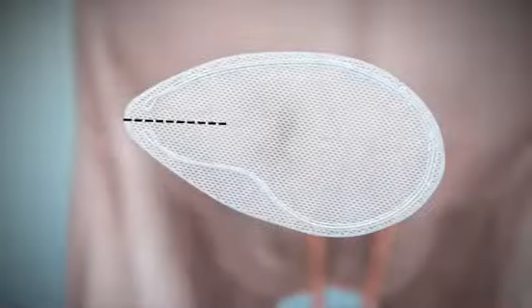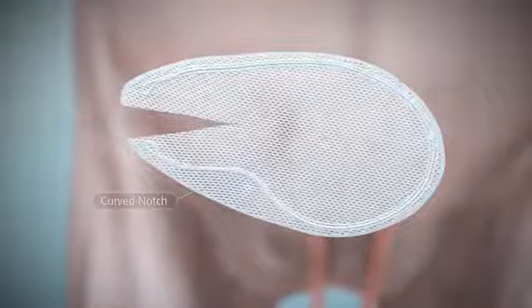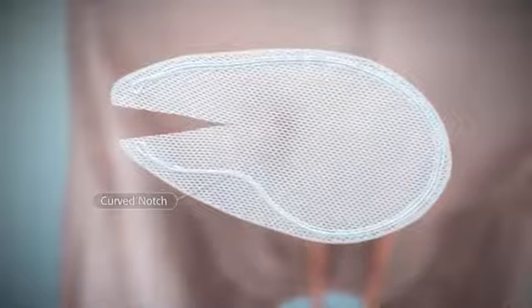Cut a horizontal slit in the Polysoft hernia patch between the interrupted ends of the memory recoil ring, down to the apex of the curved notch of the patch. Do not cut the memory recoil ring.